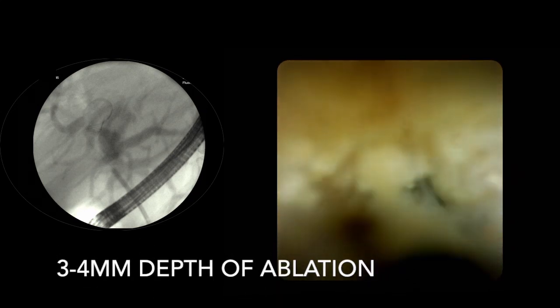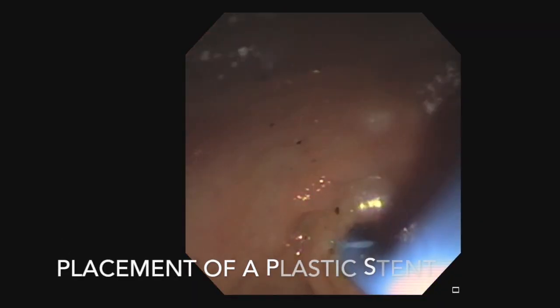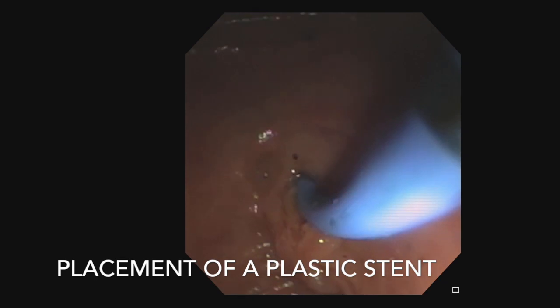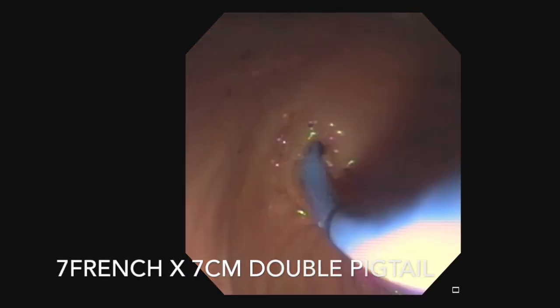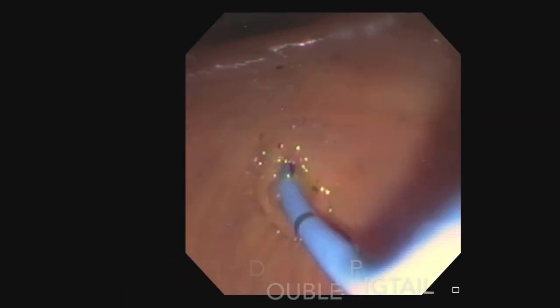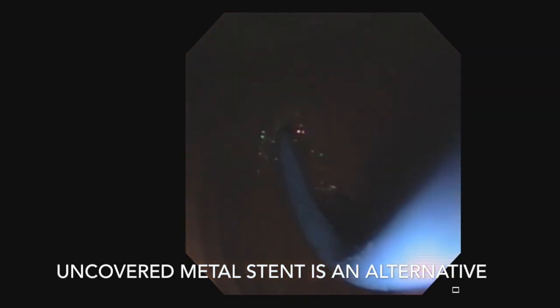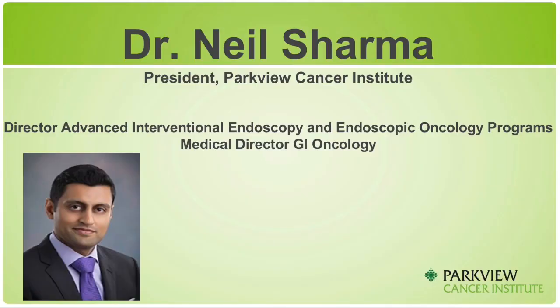Radiofrequency ablation is often used in a multidisciplinary setting. In this case, the patient is being treated in a neoadjuvant approach, working closely with surgical oncology, radiation, and medical oncology. Our goal is to get this patient to surgery; therefore, we use a plastic stent after ablation. The patient is to receive one to three total ablation treatments in combination with chemotherapy, followed by restaging and reevaluation at our multidisciplinary tumor board to determine candidacy for surgery.